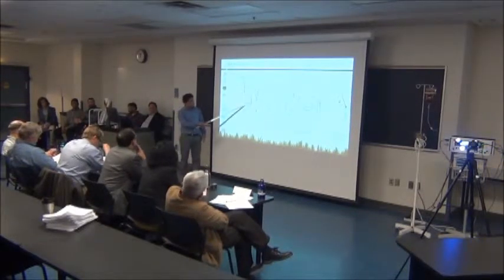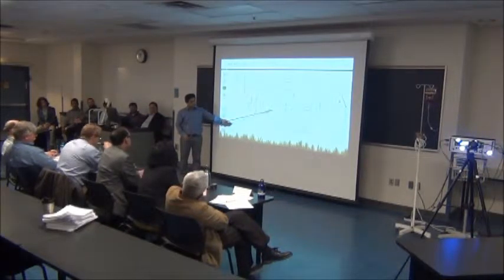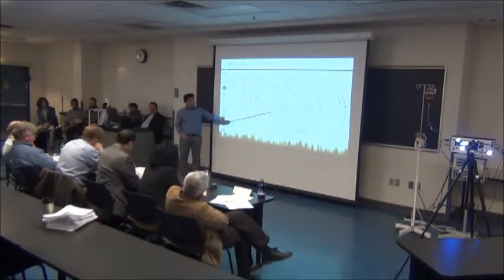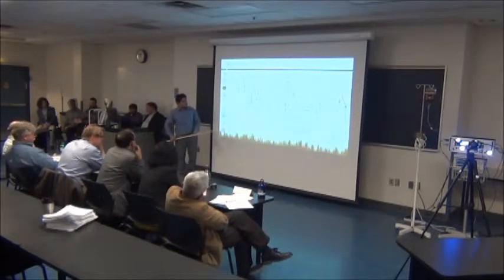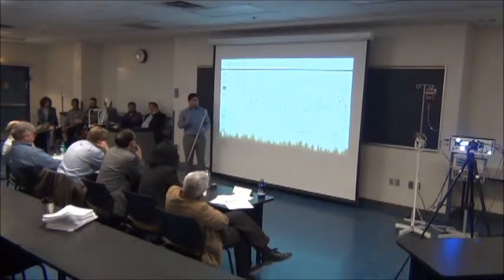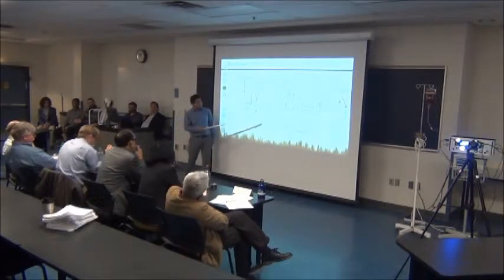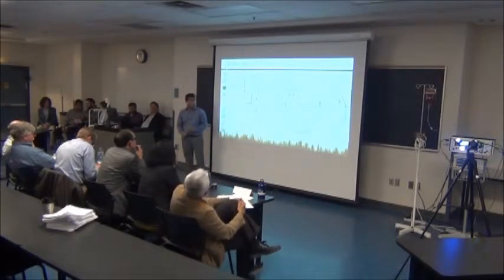The signal comes in from here and goes to the AD620, which gives a constant gain with the constant gain resistor and amplifies the pressure waveform. Then the second inverter controls the amplitude of the pressure signal up and down, and that pressure signal goes to the output and will be fed to the rest of the circuit.